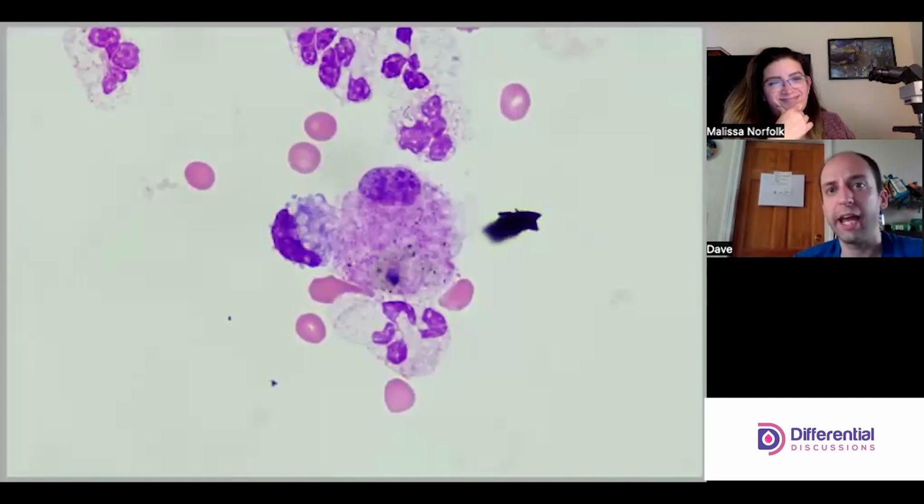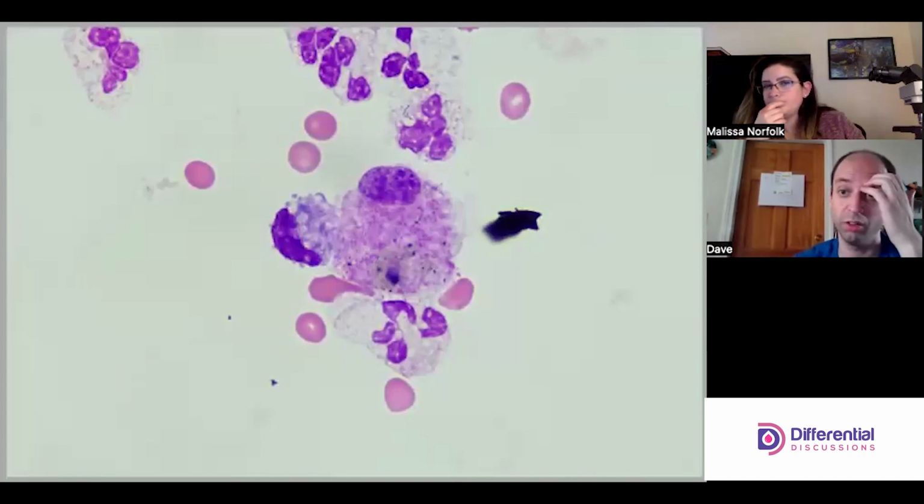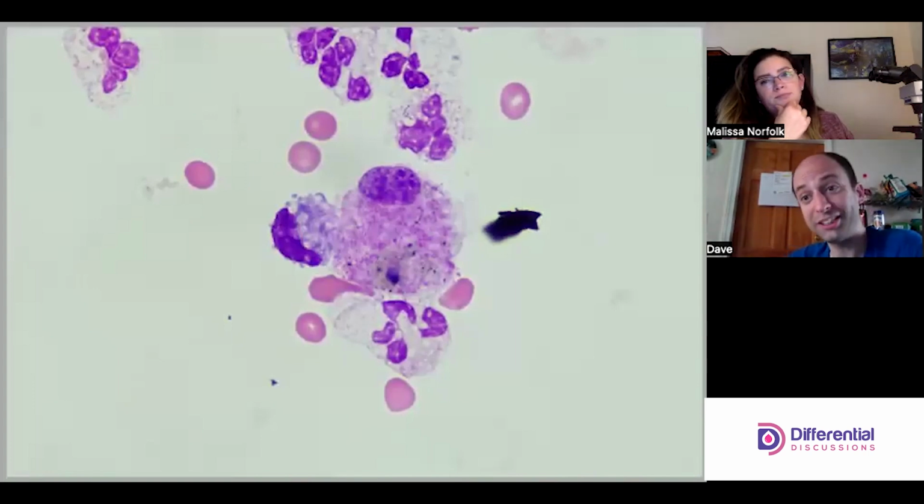When it comes to cancer, everything goes back to the genetics. That's the primary condition, right? There's some kind of lesion, improper translocation, or something wrong with the genome, and it's usually represented well in the nucleus in one or more ways. But the nuclear contour looks normal to me. There's dark clumping and then lighter areas, nothing that strikes me as odd in the heterochromatin. It's not a pretty cell, but I also don't see anything alarming.